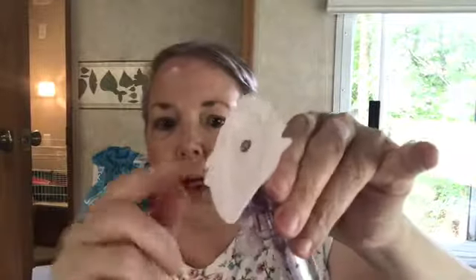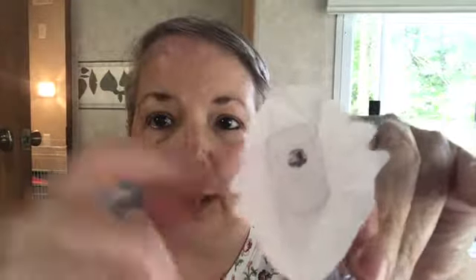Okay. So you see I curled it back a little bit. It's really not that big of a deal. And there's 2 tabs. There's one here and one here. I'll pull the first one off. That one's off. The second one is always the issue, so I have to be really careful when I pull a little bit back. Yeah, there we go. I messed it up. I always mess them up. What the heck? And you can see it looks like that. That's the sticky part that you saw. Like that. See, it's the same.